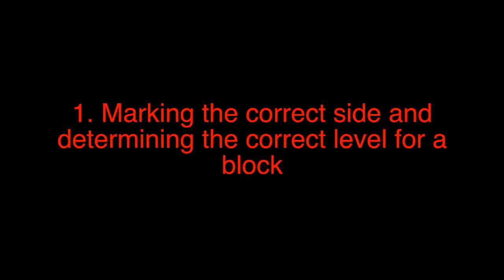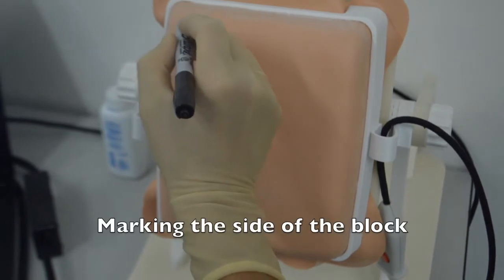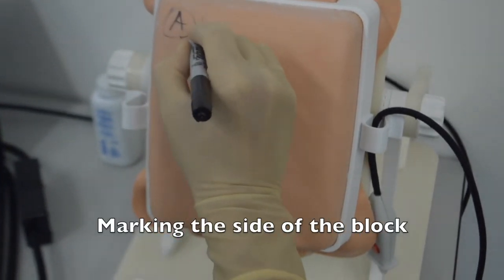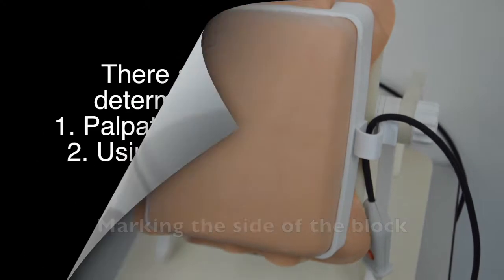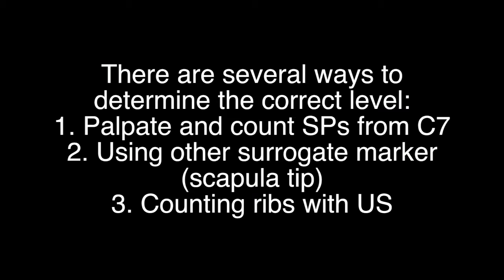Step 1: Marking the correct side and determining the correct level for a block. There are several ways to determine the correct level: palpate and count spinous processes from C7, use other surrogate markers, and counting ribs with an ultrasound.